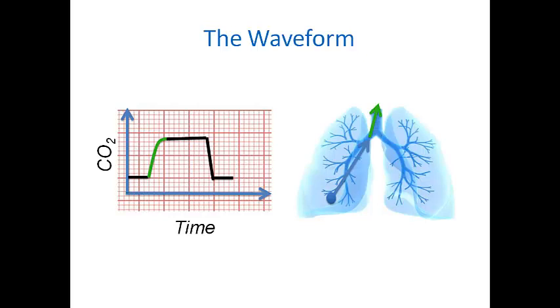As the movement of the wave goes upward, we're starting to measure both the dead space, and as we come closer to the plateau, we're measuring a mix of dead space gases, larger airways, and the beginning of the alveolar gases. The plateau is going to measure the hold of end-tidal CO2 values that have CO2 directly from the alveoli. What's important about that is this plateau is giving us a real-time reading of the CO2 that was offloaded from the capillaries just before the patient exhaled.